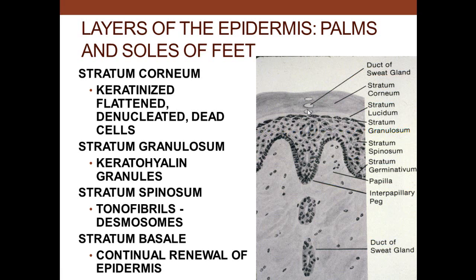And there's a basal layer. So the stratum germinativum or stratum basale right in here, this is a layer that touches the dermis. And this is the mitotically active layer of the epidermis. And so this is a source of cells that differentiate and ultimately die and slough off at the surface. So these are undifferentiated, these are differentiated versions of the same cells. These are the keratinocytes that are in there.